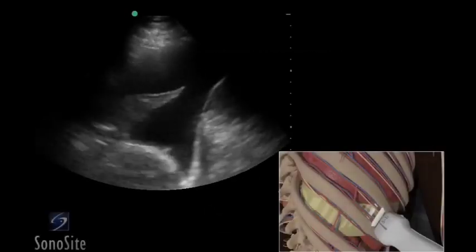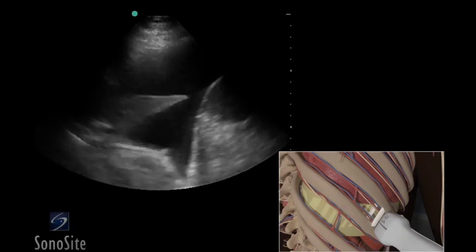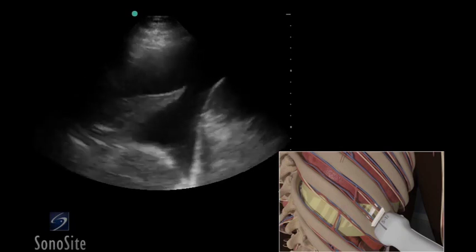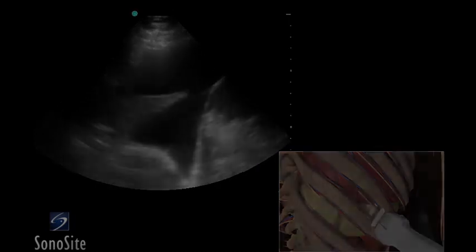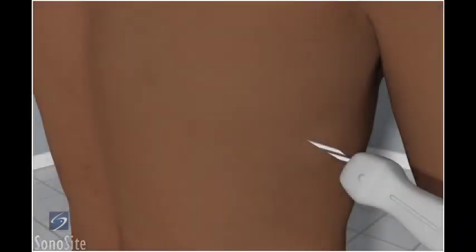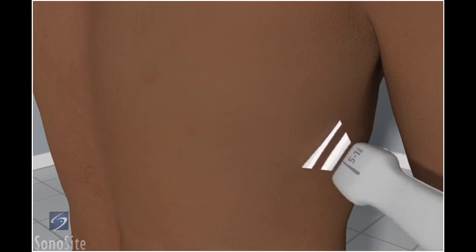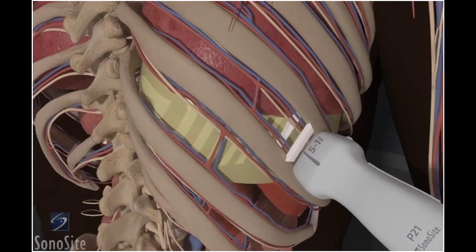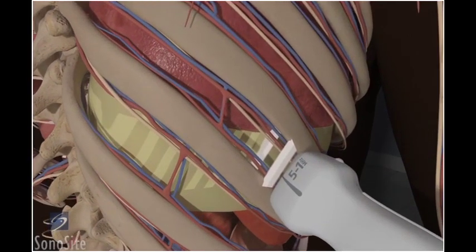A phased array transducer with an abdomen exam type is used to evaluate the chest cavity for the presence of fluid. The procedure is best performed with the subject in a sitting position, leaning slightly forward to allow access to the posterior chest cavity. The patient is instructed to breathe normally, and the transducer is placed in a long axis orientation over the posterior chest wall at the 8th or 9th intercostal space in the posterior axillary line.